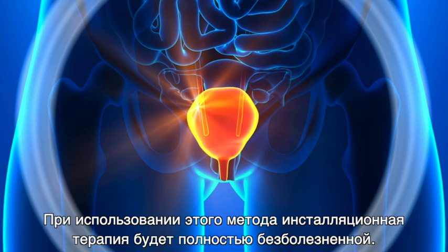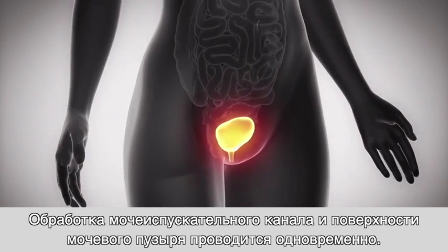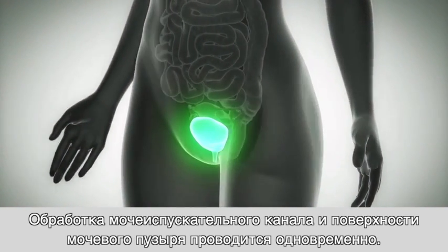By using this method, the instillation therapy will be completely pain-free and the urethra and the bladder surface will be treated at the same time. This is a new method — even doctors or urologists do not know it yet.